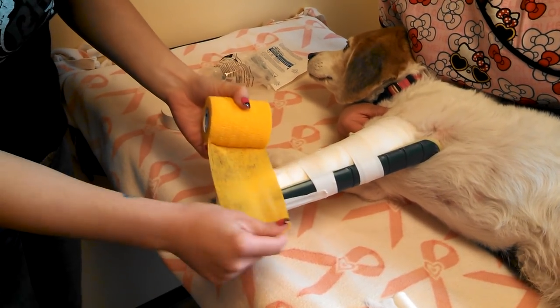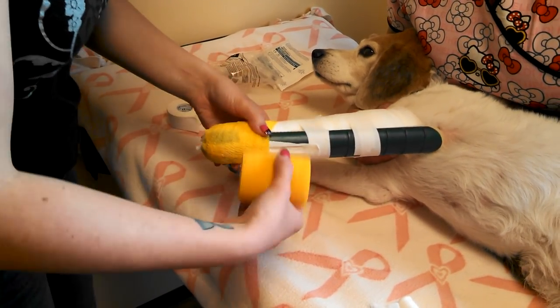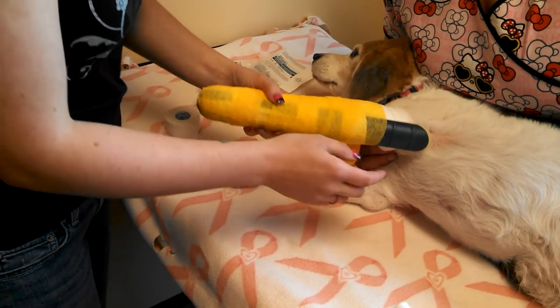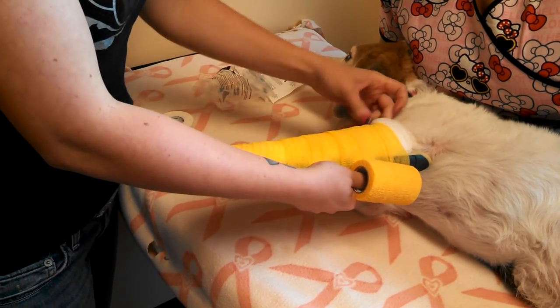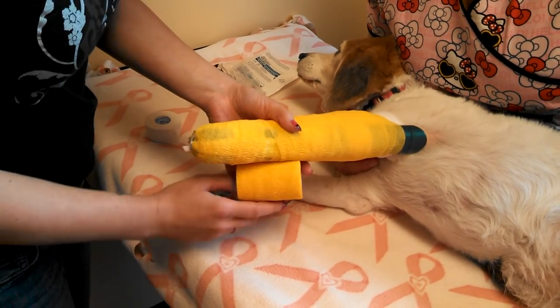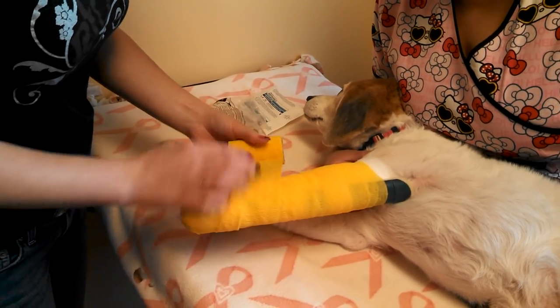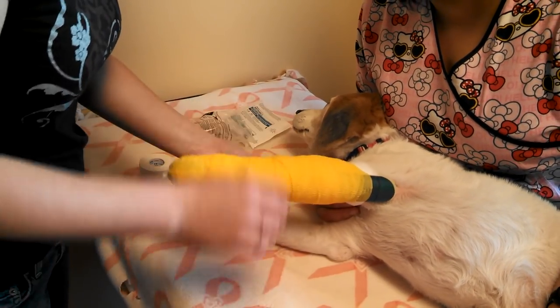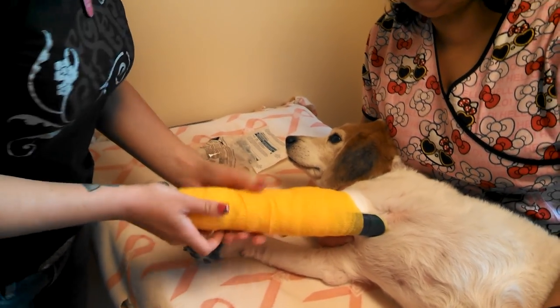I'm going to apply some vet wrap, overlapping halfway each time. This should be cut here, and normally I would wrap this up over the end. You always want to leave actual bandaging material above the vet wrap, because vet wrap can cut off circulation pretty easily. It can cause a lot of rubbing and sores too, so always leave the bandaging sticking out of the top — and there is a spoon splint.